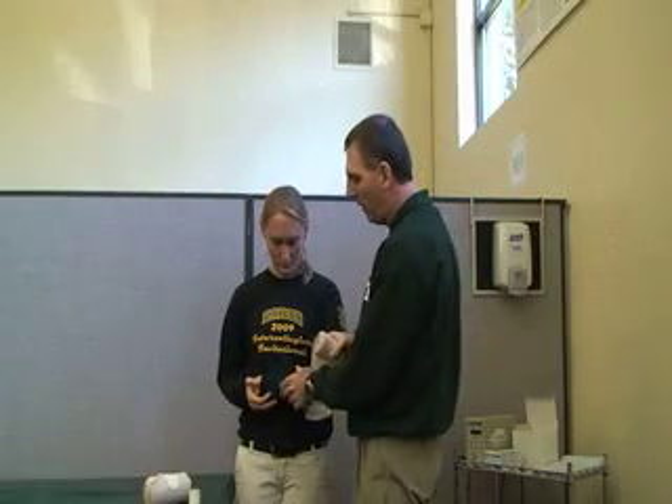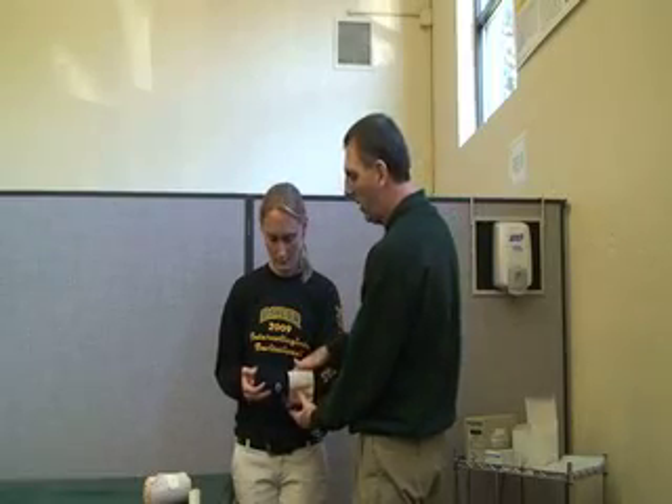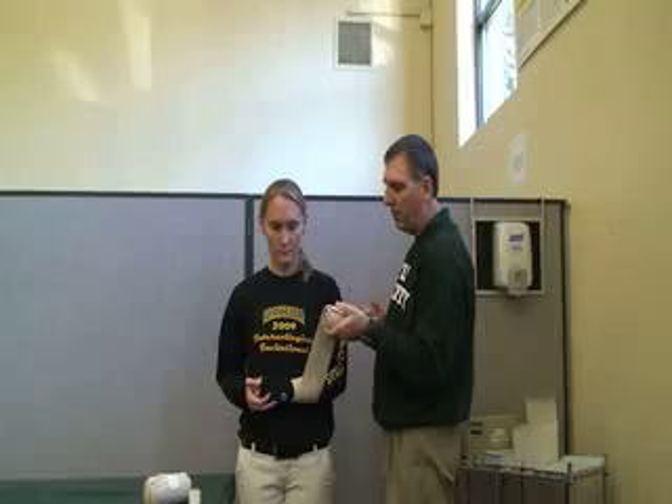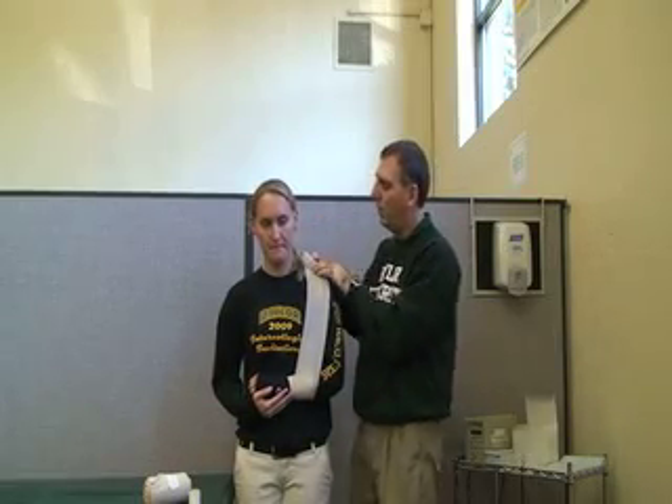First, we're going to have the athlete hold still. When you put the wrap on, you want to make sure that you're going in towards the body. We're just going to anchor it right there on the wrist, and then she's going to put her arm in a comfortable position. She needs to adjust it.